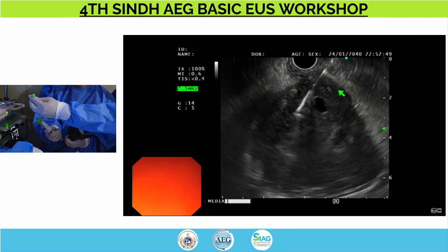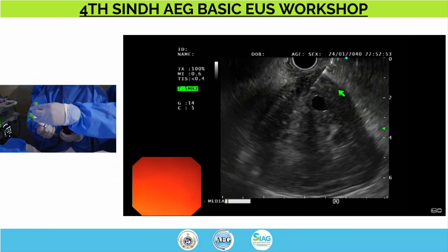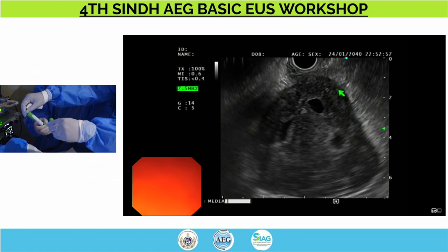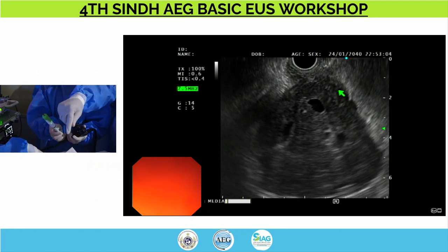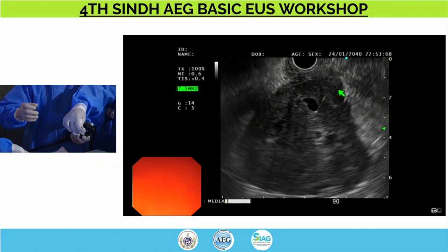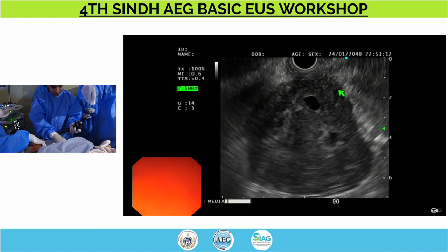So as we're pulling, we're going to take a little more tissue, and now that we are happy, I'm just going to simply withdraw the needle, pull my locking mechanism up, lock the needle, and then simply untwine and hand out the needle to our assistant.